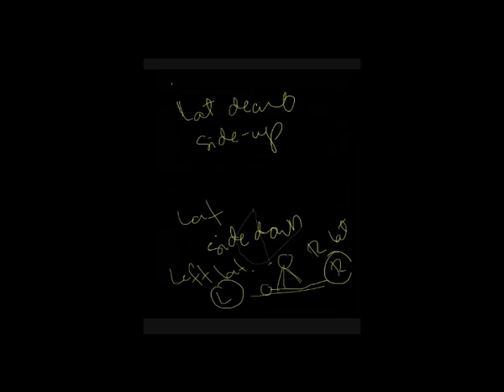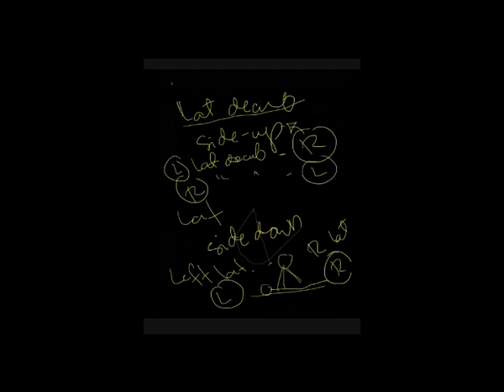Pero pag lateral decubitus, halimbawa, left lat decube, yung marker natin is right. Kasi yung taas niya is right. Pag naka-right lateral decube, ang marker natin is left. Okay? So, I hope that is clear.